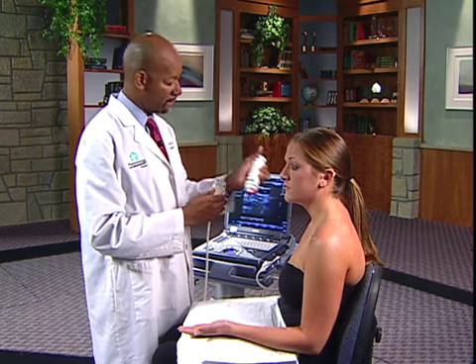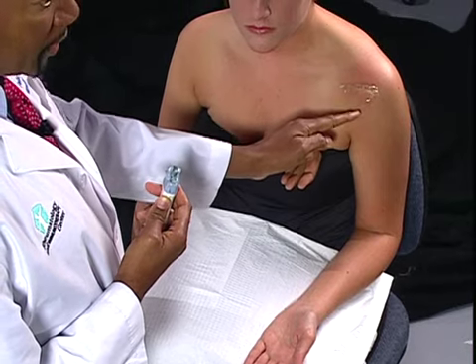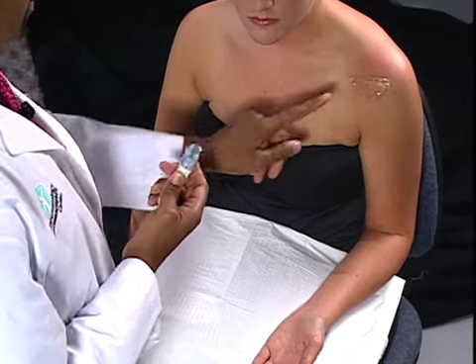Remember from the basic anatomy that the biceps tendon transverses through the bicipital groove. You also want to be sure that you keep your orientation such that the left side of the screen represents the medial portion of the patient's body.